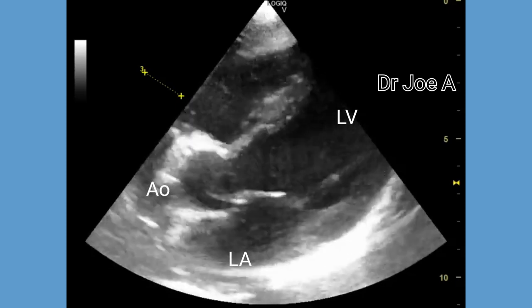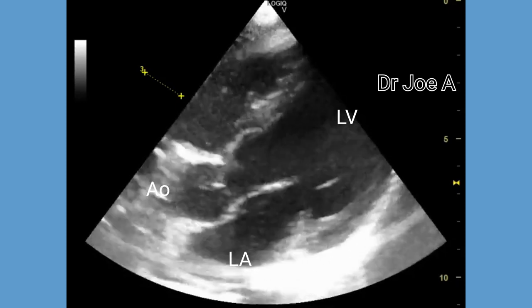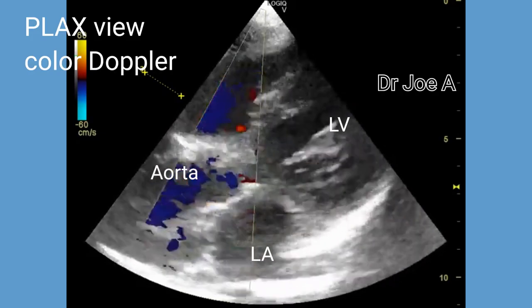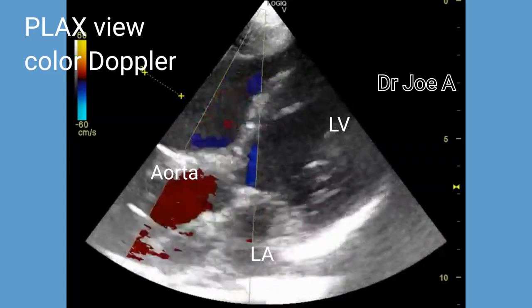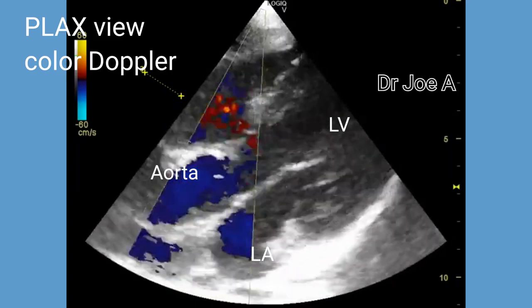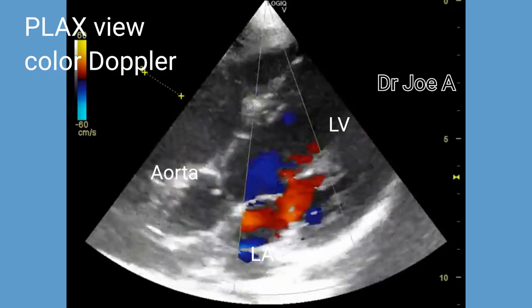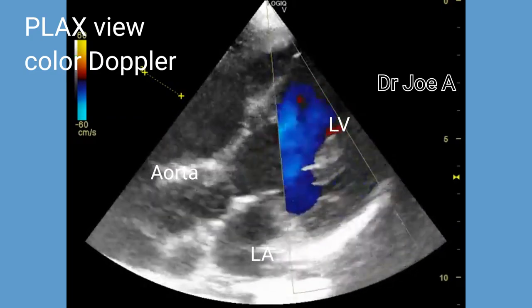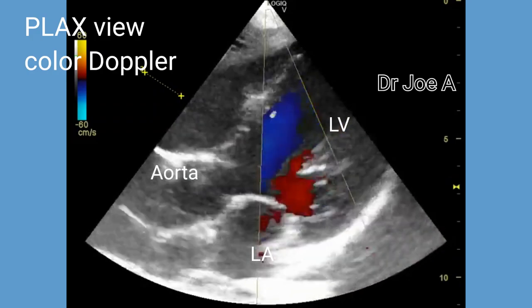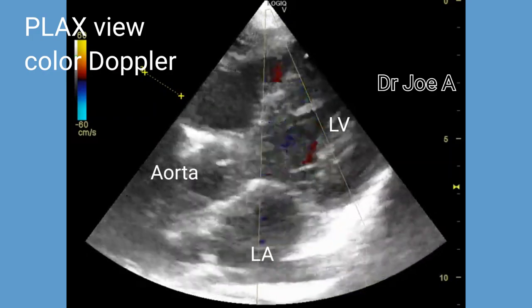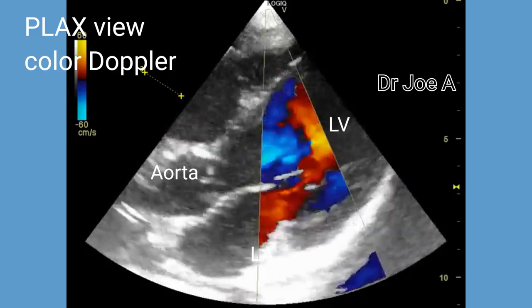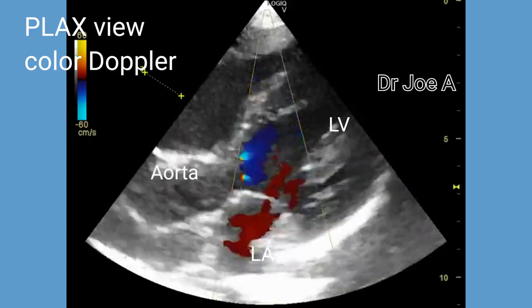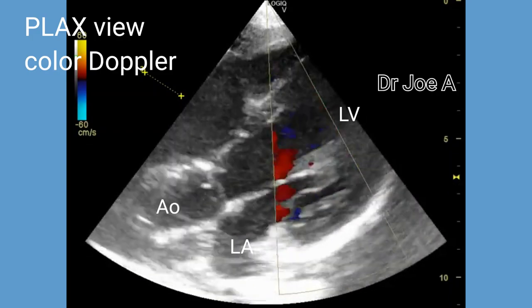It is also good practice to study the aortic valve in the short-axis view. Color Doppler in the parasternal long-axis view shows good and normal flow across the aortic as well as the mitral valves. Flow across the mitral valve is red due to flow towards the transducer, while flow in the aortic valve is blue because it is away from the transducer. There is no evidence of mitral or aortic regurgitation.